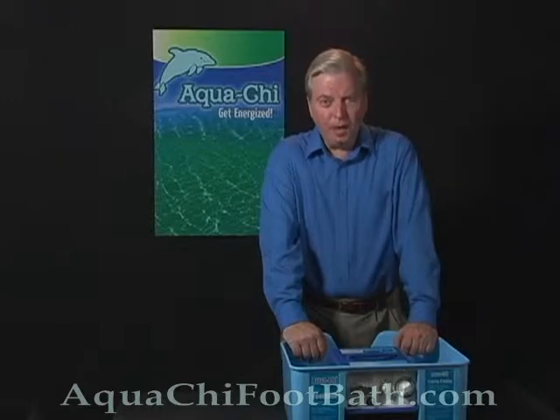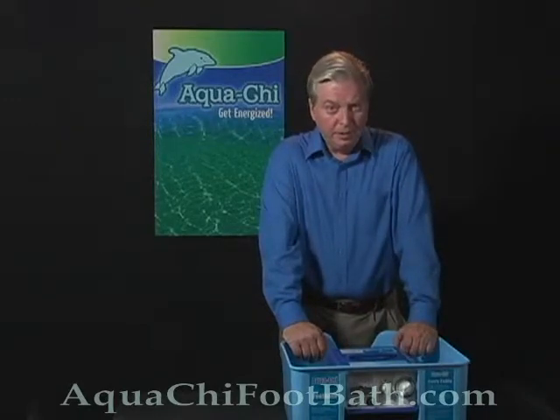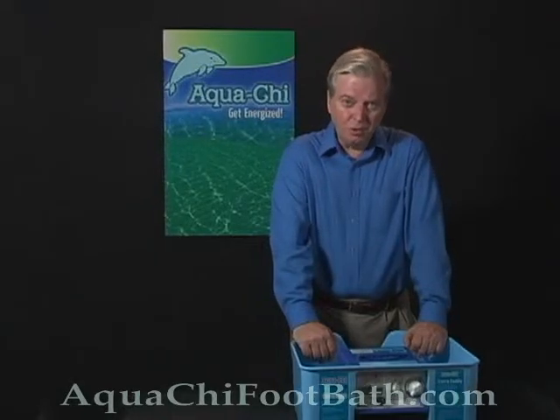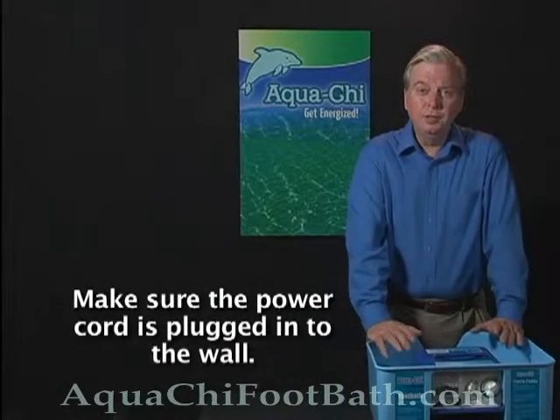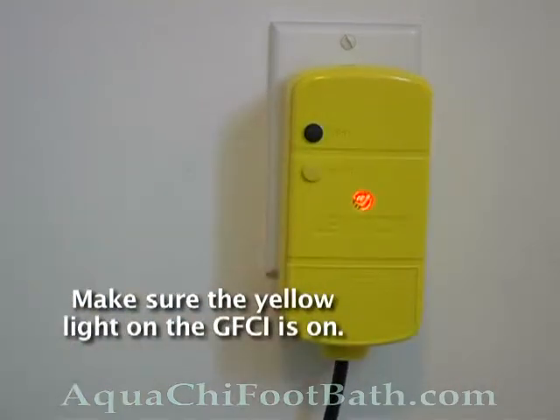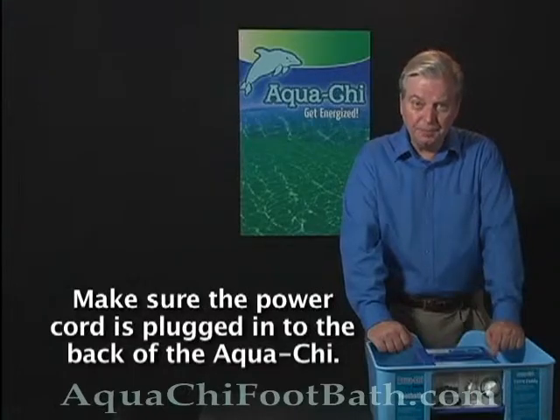The Aqua Chi is a very reliable and trouble-free machine, but should it upon occasion not function properly, here are a few things for you to check. First, make sure that it's plugged in. Check the wall, check the yellow light on the GFCI and make sure it's on. Make sure it's plugged in to the back of the machine.